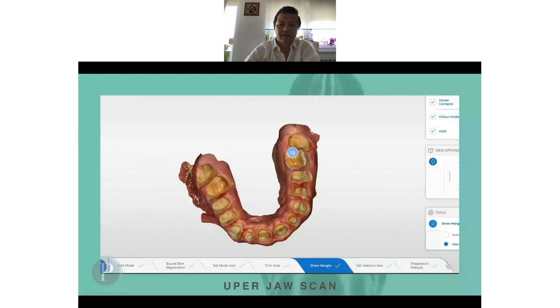So, trying to be minimal invasive, we had for this patient about 28 units, I think. For example, tooth number 16 was an inlay, because I didn't want to prepare the whole surface of the tooth, because it was unnecessary. It was a molar region, and because of the young adult patient, my approach is to be mostly minimal invasive.